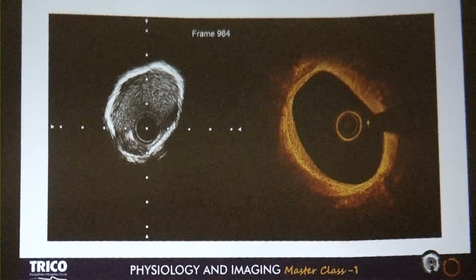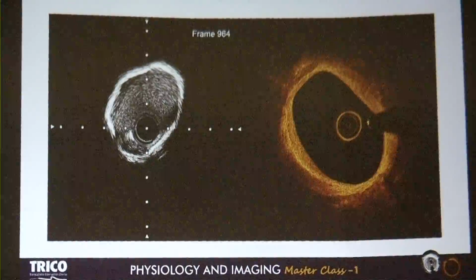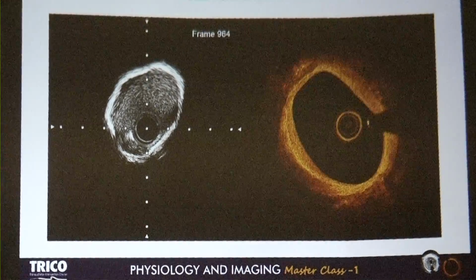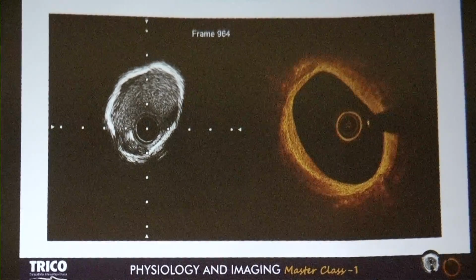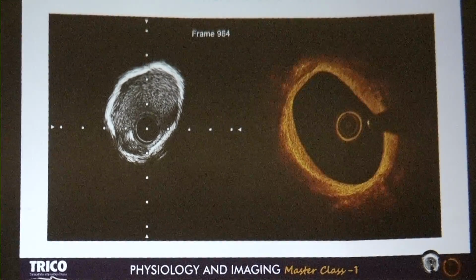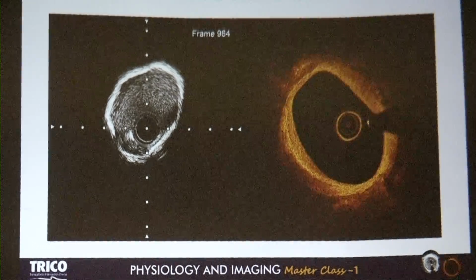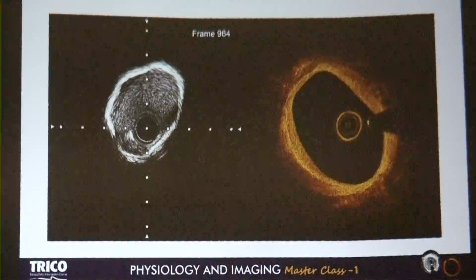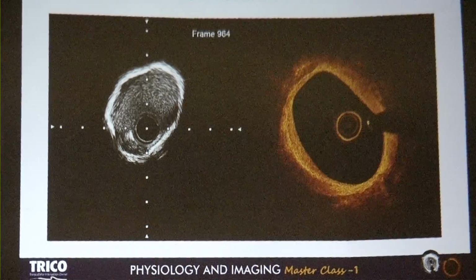Yeah, on IVUS, like here, predominantly fibrosis area, if you try and do shock wave, it's not going to work, and still you feel that shock wave has done a great job if you have only IVUS. Or even rotablation, whatever. Acute MI, so rotablation we avoid.